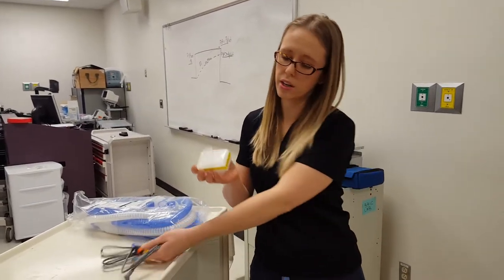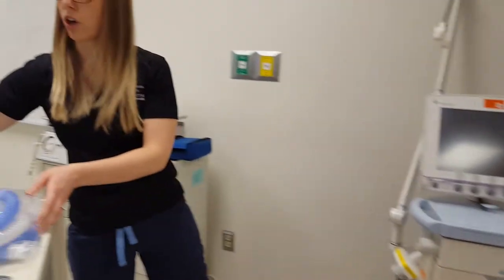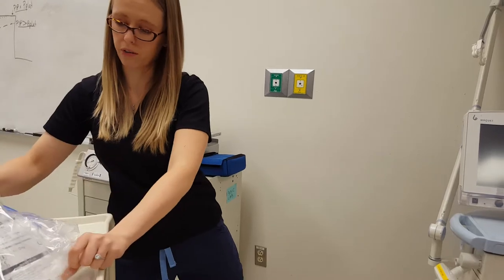Take your HEPA filter and apply it to the expiratory limb. The ventilator will tell you which is inspiratory and which is expiratory. Some ventilators do not label these, however the Cervo-I does.